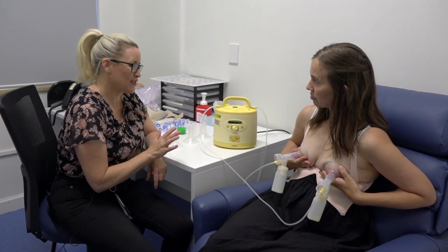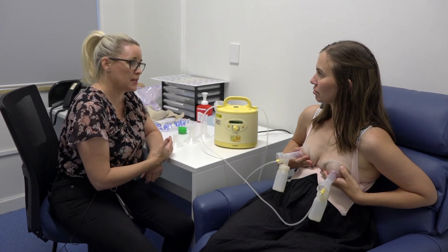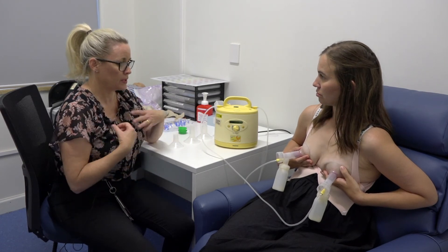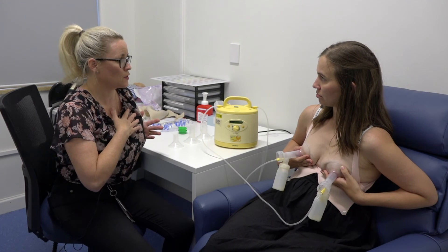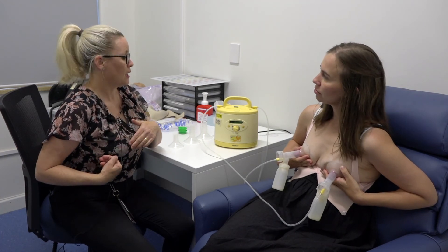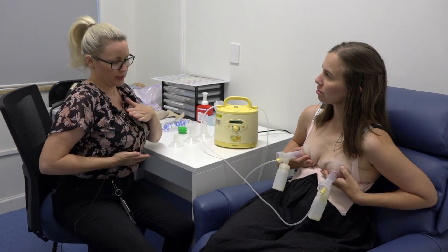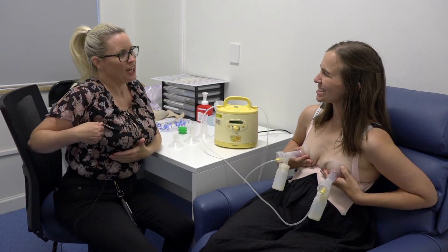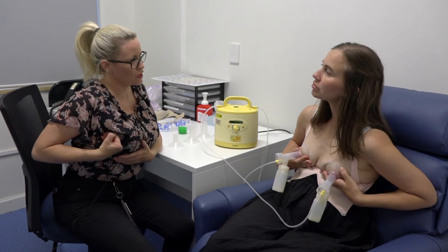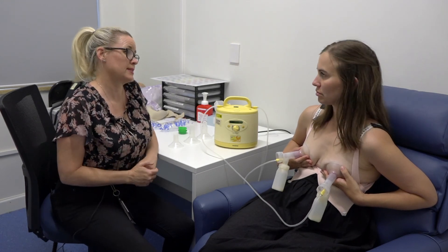As an average guide, you'll probably be pumping for about 10 to 15 minutes, but really for as long as it takes for your breast to feel softer, lighter, and without any lumps. If you find that after double pumping one breast feels nice and soft with no lumps but the other has a lumpy area, take one off and do each breast singly for about five minutes. Then with your free hand, use it to gently — and I do mean gently — rub over that lumpy area and then gently towards your nipple whilst pumping. That will help to clear that lump and get the milk flowing more freely and easily again.